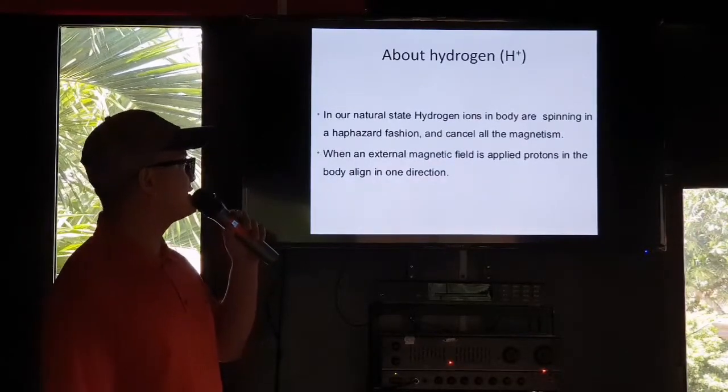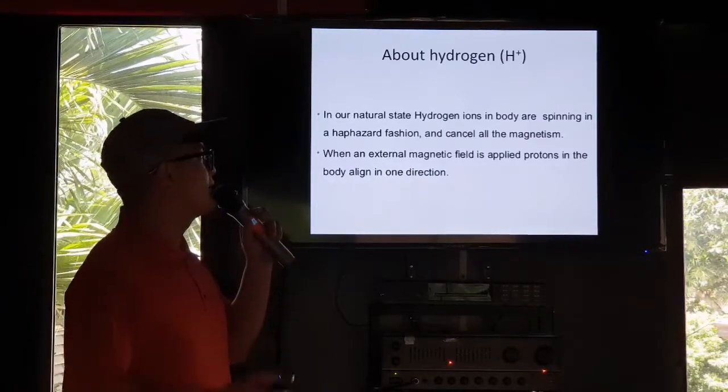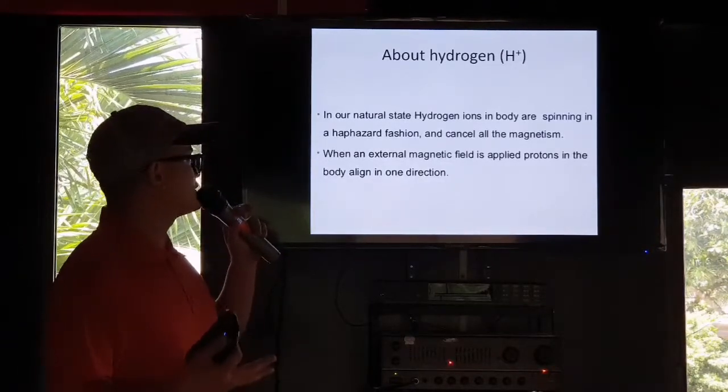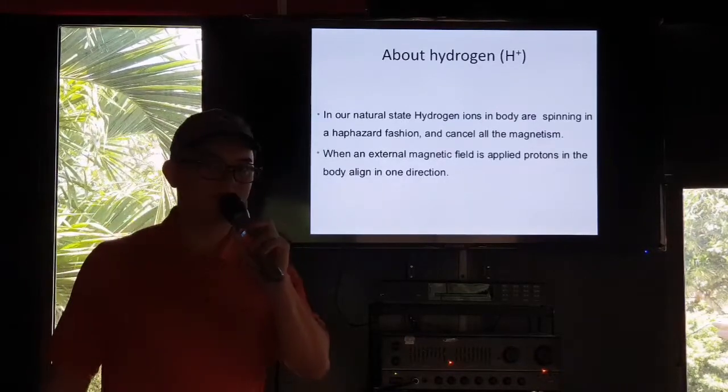Okay, in our natural state, hydrogen ions in the body are spinning in a haphazard fashion and cancel all the magnetism. Of course, when an external magnetic field is applied, protons in the body align in one direction.